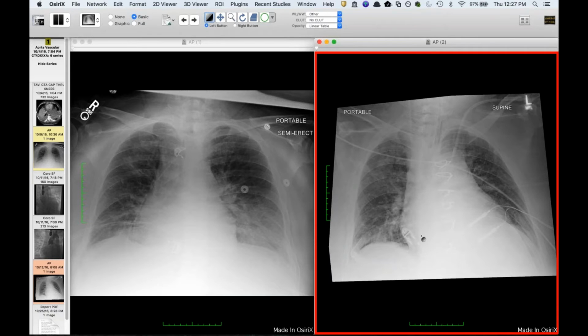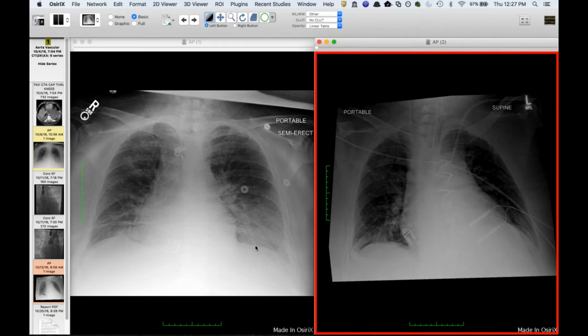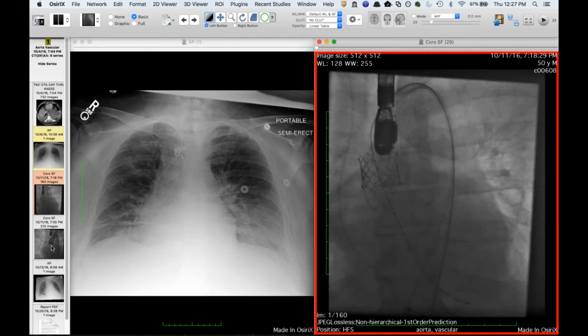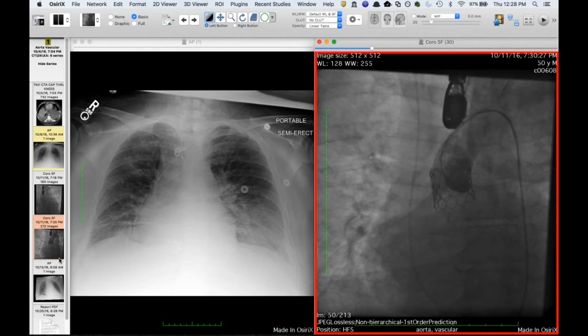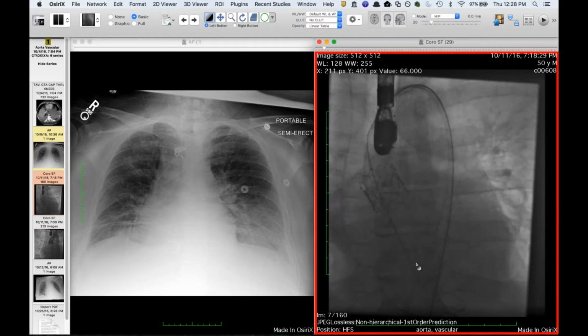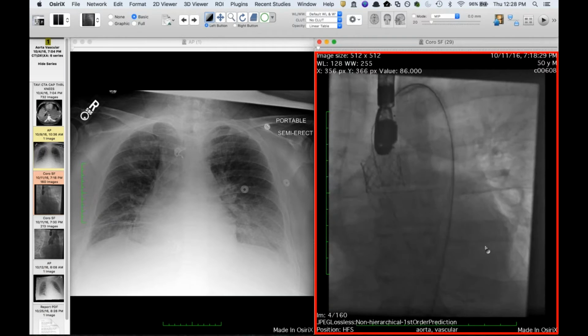And the reason for the median sternotomy was not that they were intentionally going to do an open aortic valve replacement, because surgery had actually declined to operate on him at first. So what they tried to do was a transcatheter aortic valve replacement. You can see that the valve looks okay here, except that the valve wasn't okay for long, and the valve dislodged, and you can see it kind of bouncing up and down in the aortic annulus. Eventually it ended up back in the left ventricle, and they had to go in and do a sternotomy to remove the valve from the left ventricle.